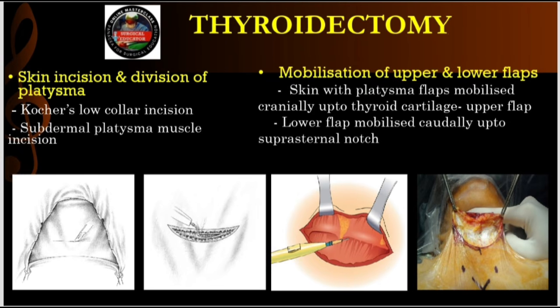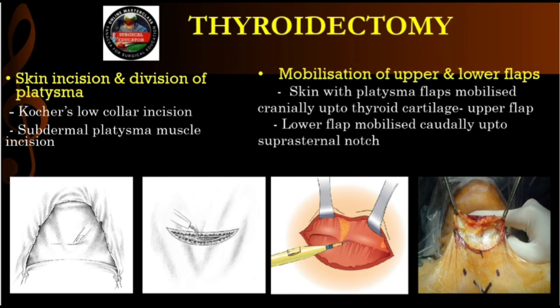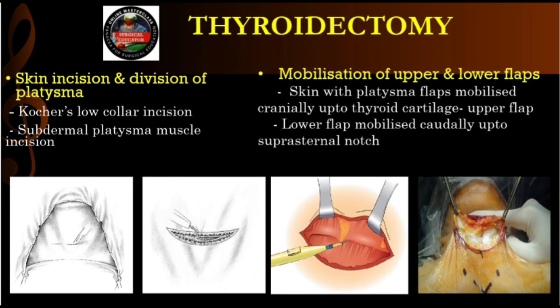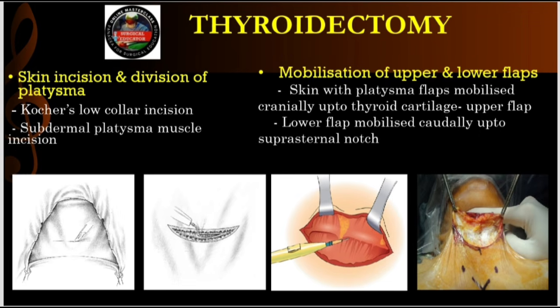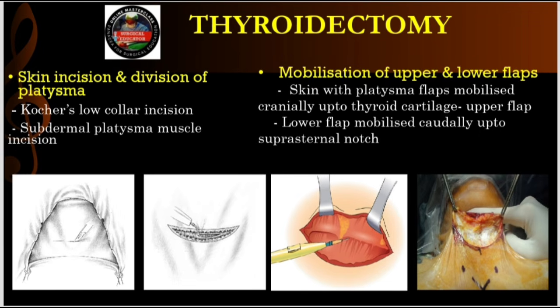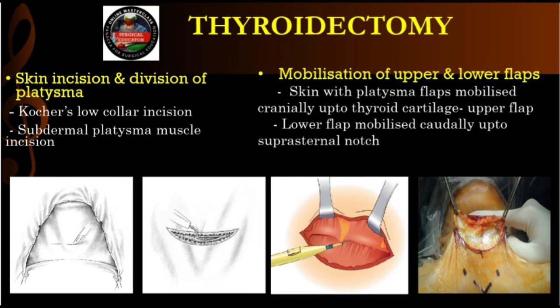That is exactly why the platysma is so architecturally brilliant. The blood vessels supplying that skin run in the subdermal plexus, which sits superficial to the platysma. Sandwiched between the muscle and the fat. Right. So we don't separate the skin from the muscle. We lift the skin, fat, and platysma all together as one composite unit. We do our dissection deep to the platysma in the subplatysmal areolar tissue plane. The space underneath. Yes, because that plane is filled with loose avascular connective tissue. You can just sweep your instruments through it with practically zero bleeding. So the platysma acts as a shield, protecting the blood supply above it.